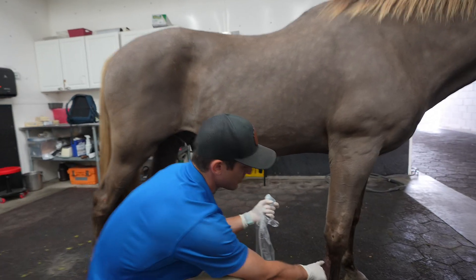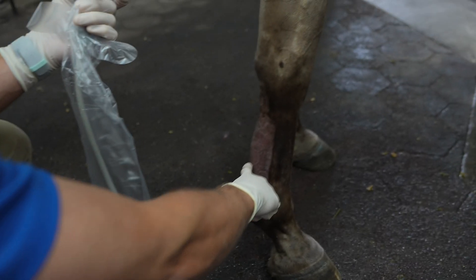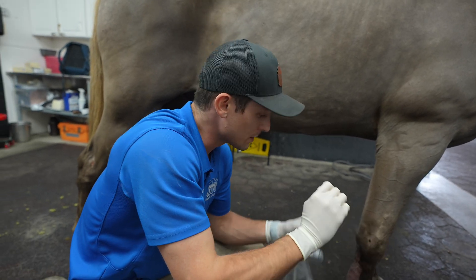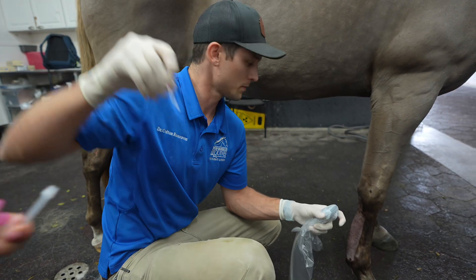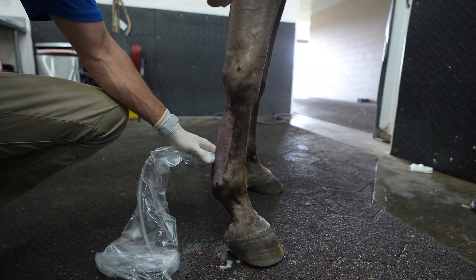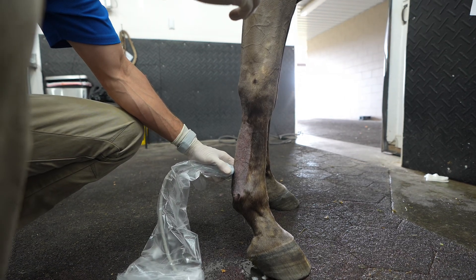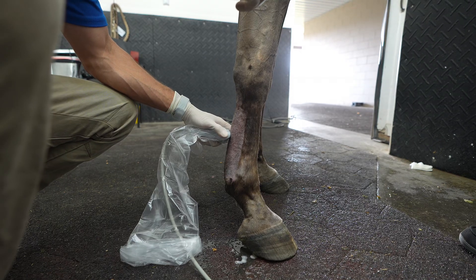Severe superficial digital flexor tendonitis is causing this big banana on the back of the leg. What we're going to do is go in there with the ultrasound, put some platelet-rich plasma in there, and try to get the best healing response we can out of these tissues. We're going to go in a few different spots, seed this whole tendon, and figure out where we can help the most.